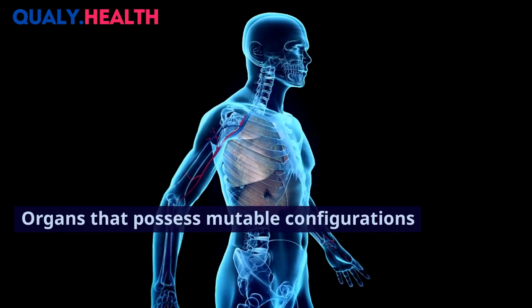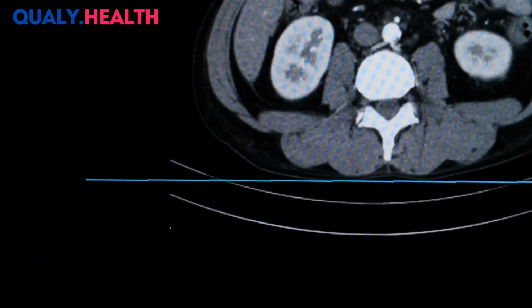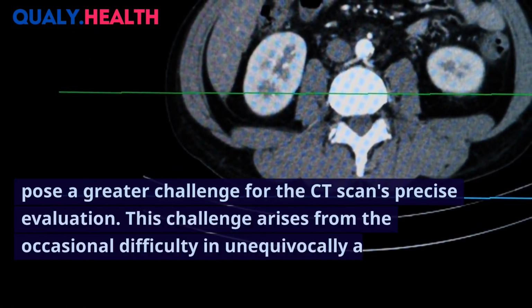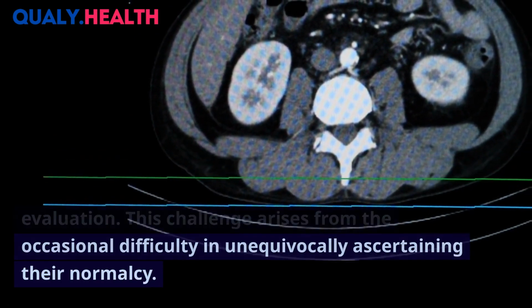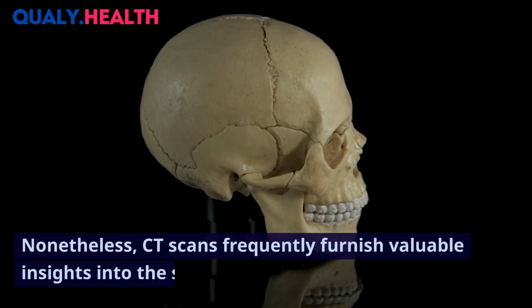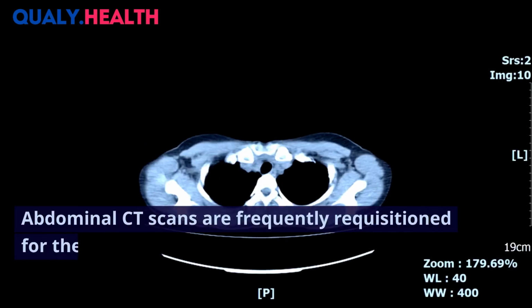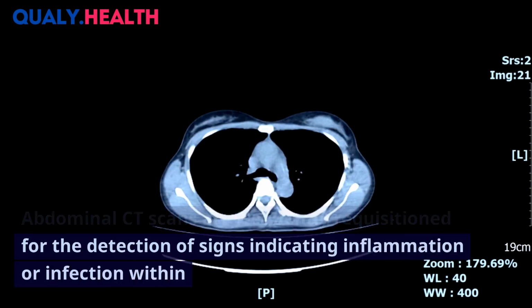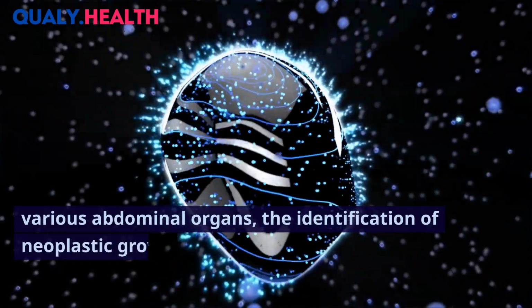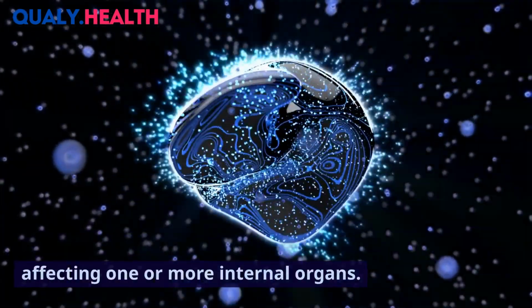Organs that possess mutable configurations contingent on their repletion, such as the stomach and intestines, pose a greater challenge for the CT scan's precise evaluation. This challenge arises from the occasional difficulty in unequivocally ascertaining their normalcy. Nonetheless, CT scans frequently furnish valuable insights into the state of these organs. Abdominal CT scans are frequently requisitioned for the detection of signs indicating inflammation or infection within various abdominal organs, the identification of neoplastic growths, or the diagnosis of injuries affecting one or more internal organs.